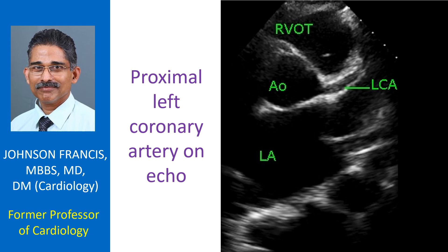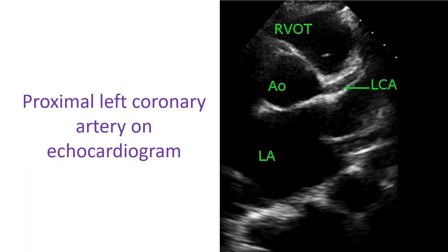In this case, the proximal left coronary artery is mildly dilated, possibly because of underlying valvular lesions with left ventricular dilatation and hypertrophy. Coronary arteries are relatively easier to image in children, while in adults the echo window is often not good enough for imaging coronary arteries by echocardiography.